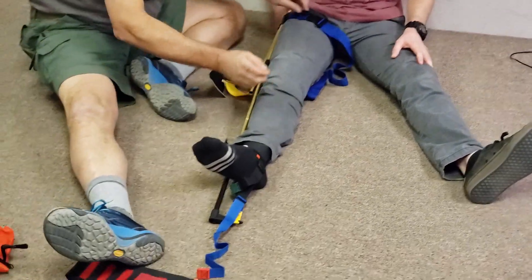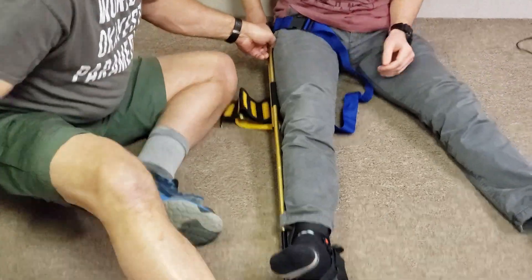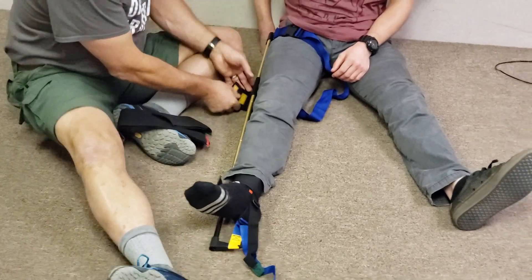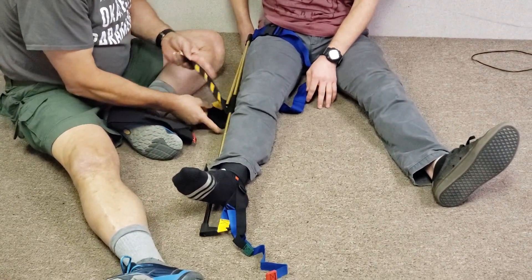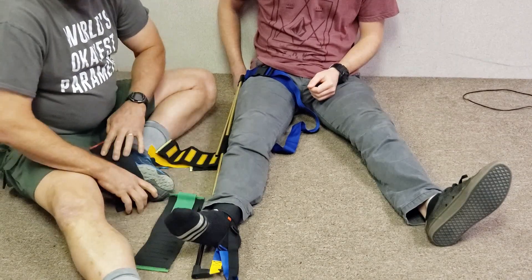You have three other straps. Normally the middle strap, which goes over the knee, should be applied first. That's the only strap with a real priority — it helps pin down the pole to the leg. If you don't start there it's not a huge problem, but it's the best practice.